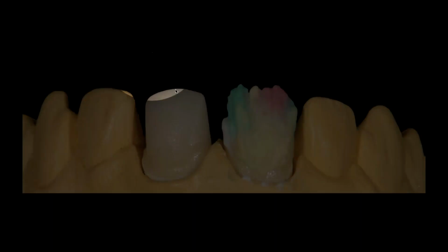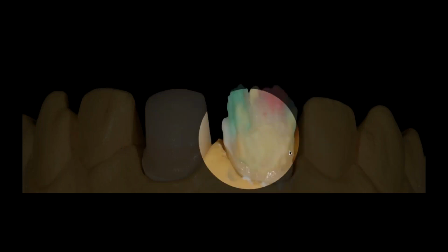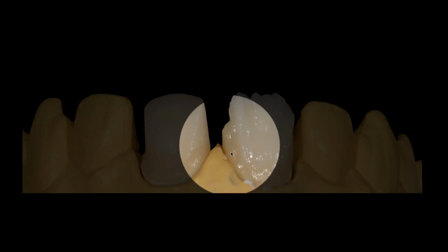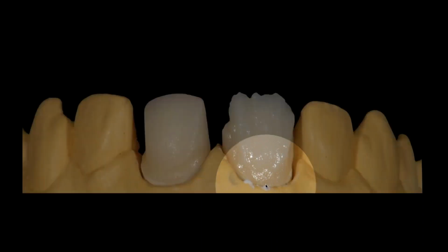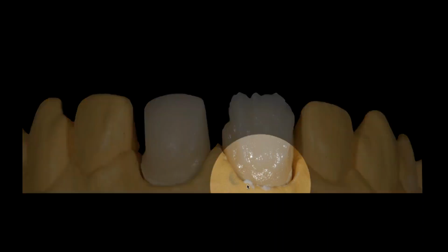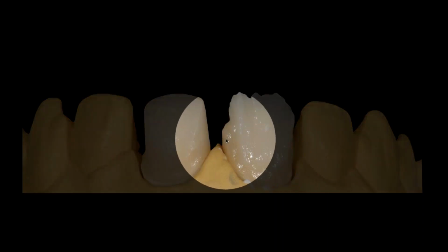But again, notice on the number 9, I've done nothing. I put no Opacious Dentin, no powder on it whatsoever. I'm only working Opacious Dentin on one of the restorations. Okay, and I'm going to fire that. And I hope you notice right away that as I'm firing it, you can notice how much the chroma is more intense interproximally and less intense as it comes down to the cervical. That's based on the thickness. So again, the opacity here is king, because the more I have, the more chroma comes out. The less I have, the less chroma is there.